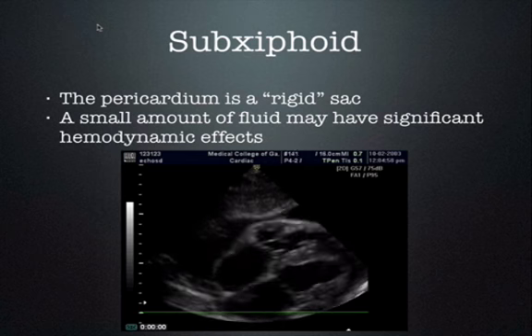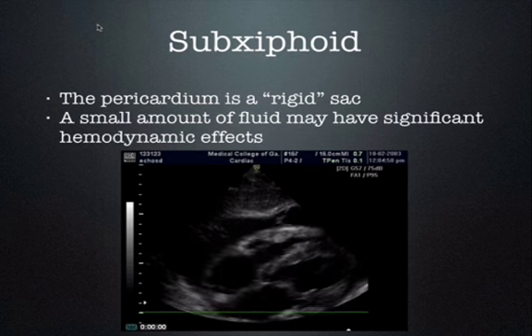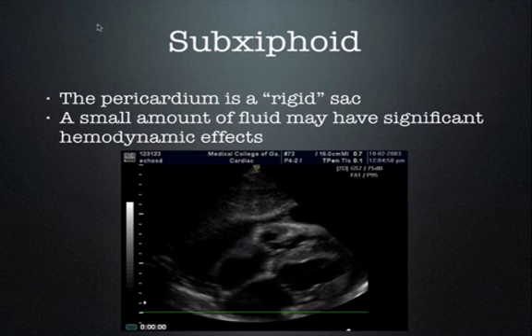Remember, a small amount of fluid in a trauma patient may have a massive hemodynamic effect. So small does not necessarily mean that it's insignificant.